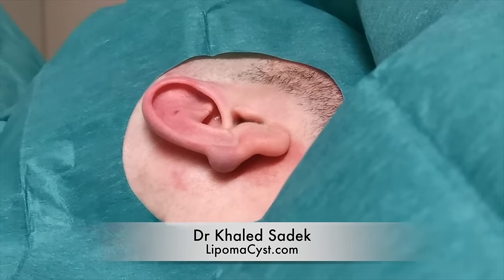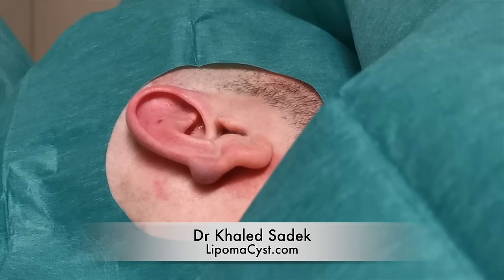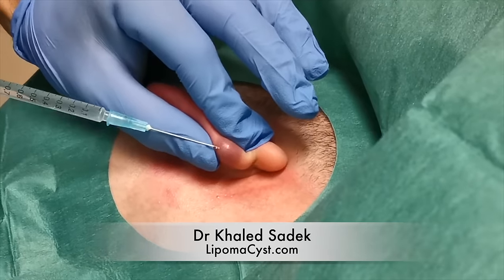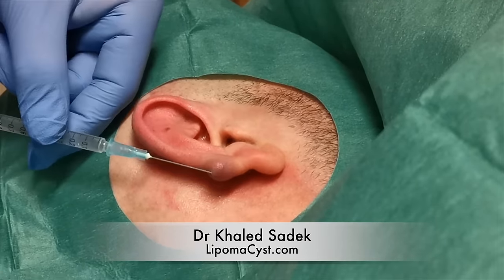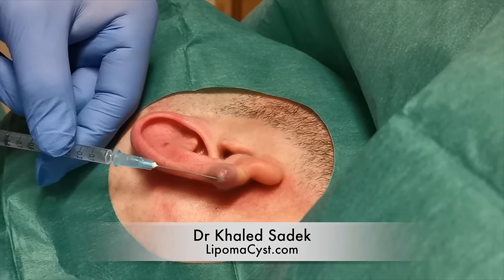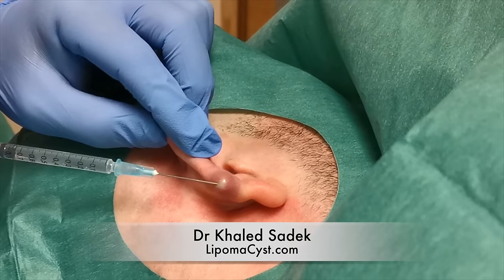First up is the local anesthetic — this is the stinging part. We're just going to pop a little bit into the top of it without rupturing the cyst. Sharp scratch. Just applying the anesthetic, and as you can see, it is just gently blanching.